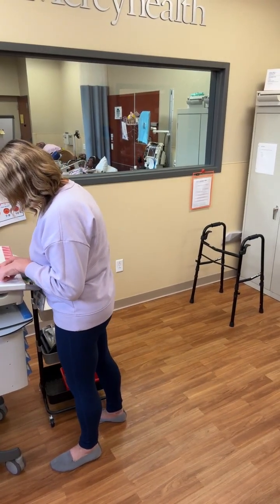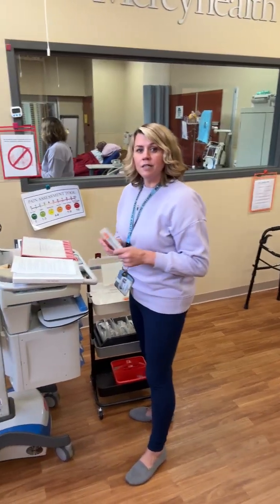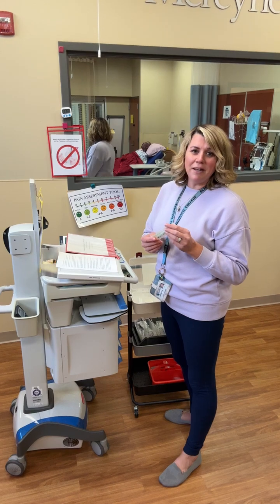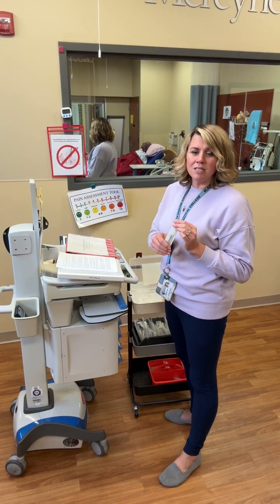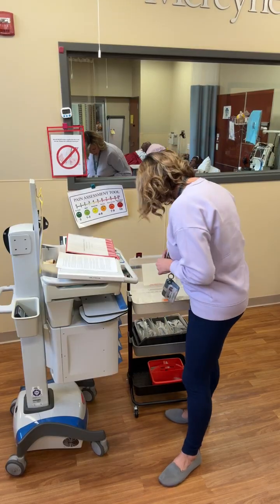If you are expected to inject insulin, again, there are supplies here. You'll take your needle out. A lot of the stuff we have may be expired, but it's okay to continue to go through your med checks like you're expected to do in skills and confirm that the supplies that you have are indeed safe to use.